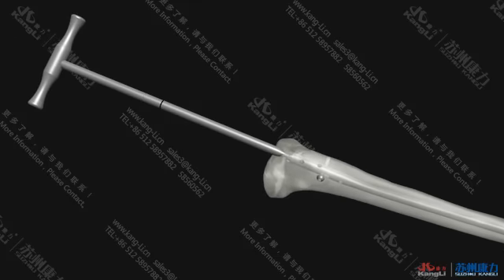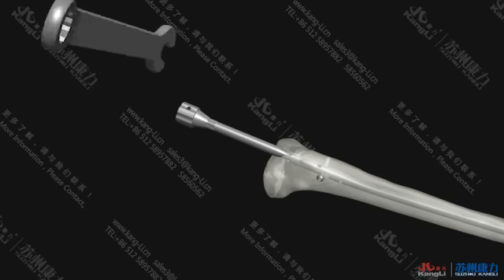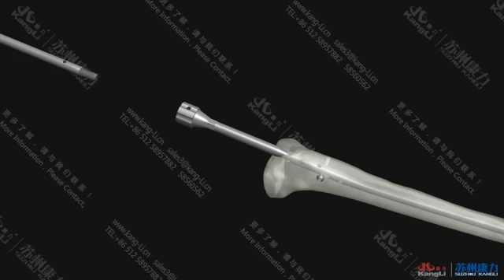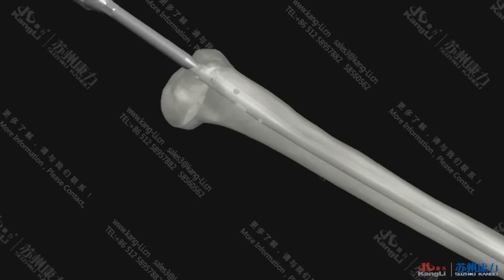Remove the end cap with the 3.5T hexagonal screwdriver. Install the nail extractor on the tail end of the nail of the KTO Tibial Intramedullary nailing system. Screw tight with an open-end wrench, and then connect it with the slide hammer guide bar. Remove the last locking screw left and extract the nail of the KTO Tibial Intramedullary nailing system with the slide hammer.